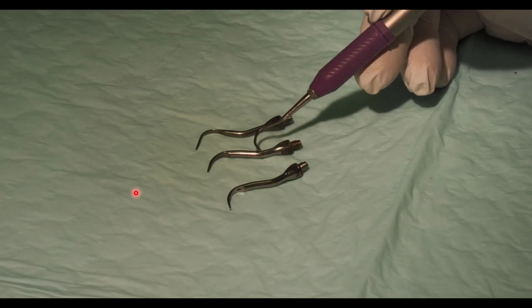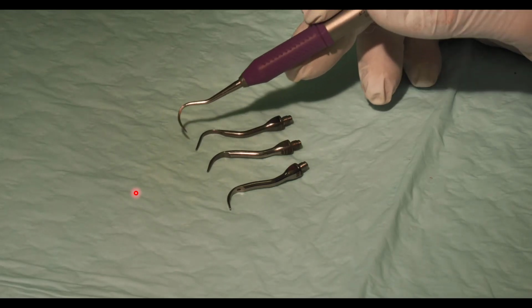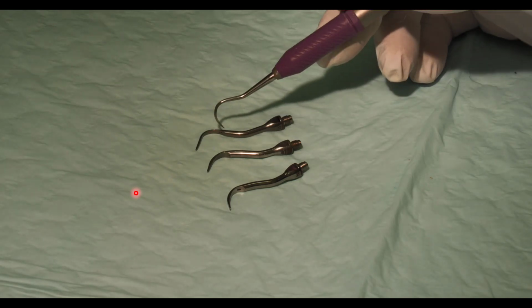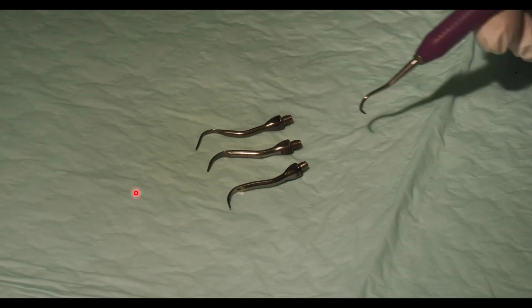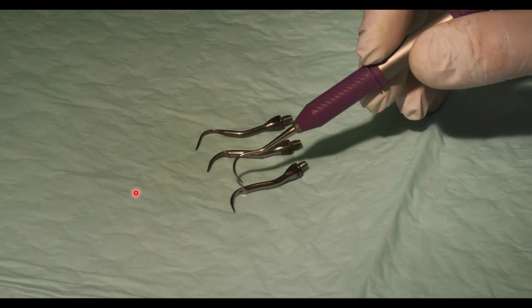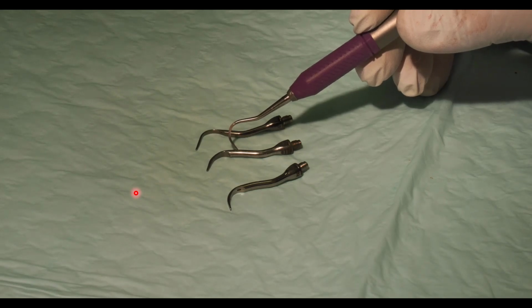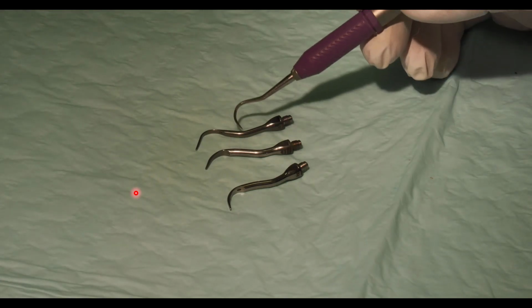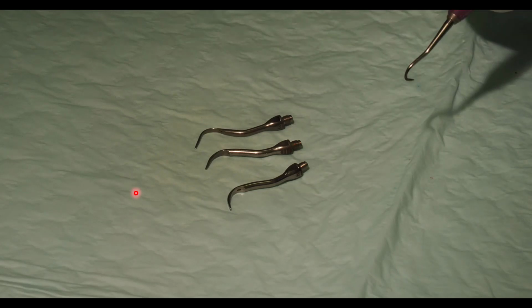If you're doing good subgingival cleanings, you should invest in a subgingival specific tip, really thin, longer, and the water coolant will come out and cool the tip of it very effectively. So in review, supragingival, don't put that underneath the gum. Universal can go anywhere. You should turn the power down if you're using this underneath the gum though. And then finally, a nice subgingival tip for your deeper pockets, which will gently clean the tooth without damaging it.